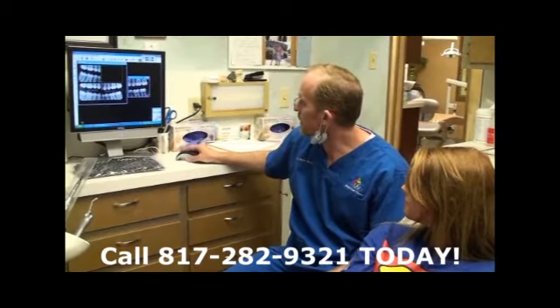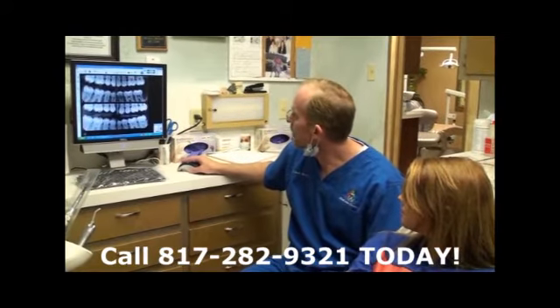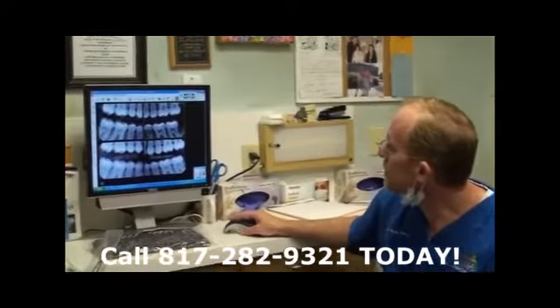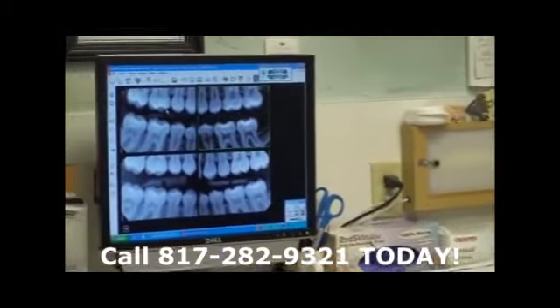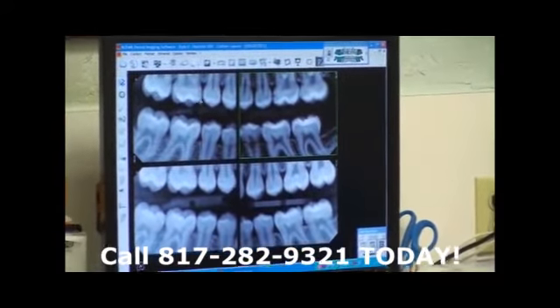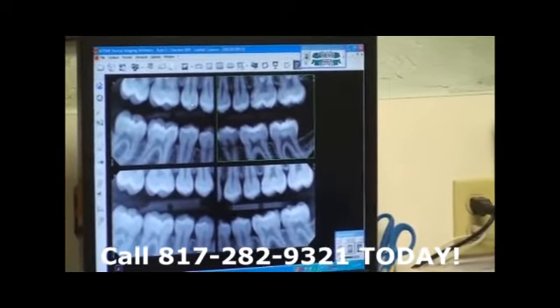Let's put this back in here. Alright. Now when I look at the upper right, you have the beginnings of a cavity, what they call an incipient lesion, meaning that it's not quite a cavity that goes through the enamel. It's not cavitated, meaning there's no hole, but there are signs that the enamel is demineralizing, which means that it could turn into a cavity.